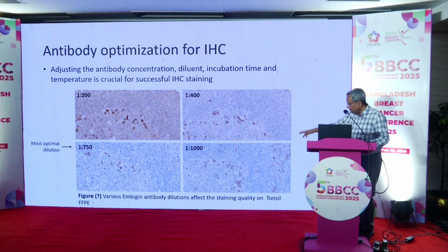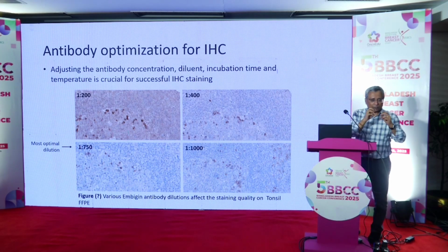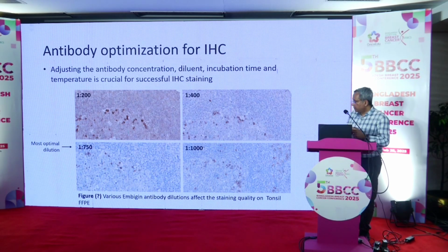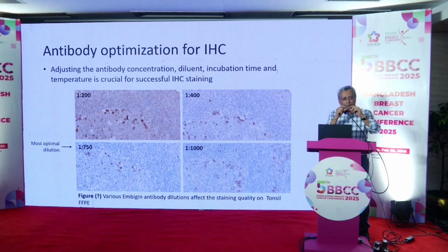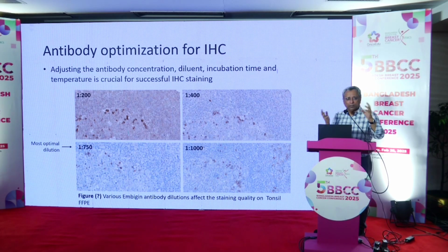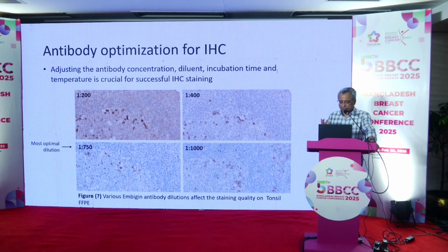At 750. But also you have to balance your target cells, right? How do the target cells stain? A very crisp staining of your target cell against a negative background should be the optimum. That should be our aim to achieve. But sometimes you have to balance between all the different factors. It's not always ideal that you will get a very optimal picture.